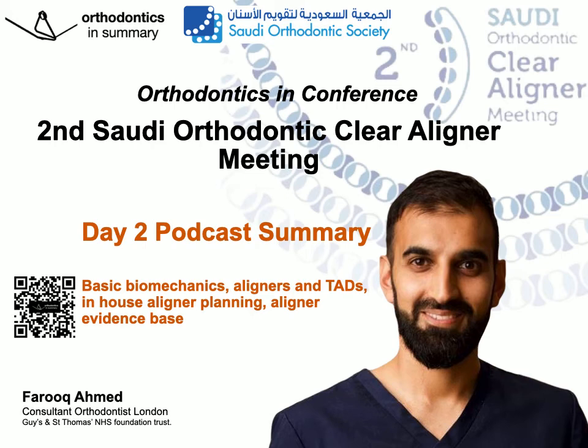This lecture is entitled Clear Aligner Therapy, Empty Promises or Wishful Thinking by the academic Beom Kim. Kim started off by describing if aligners work well. He mentioned that the ClinCheck from Invisalign doesn't represent the final patient's occlusal outcomes. Now, I think that's no new information to any of us, but he mentioned that this was only published by Brushang in 2015, and it took 15 years from the inception of Invisalign for us to really work this out, and he just put into context our level of understanding of aligners, and the rest of his lecture followed this theme.